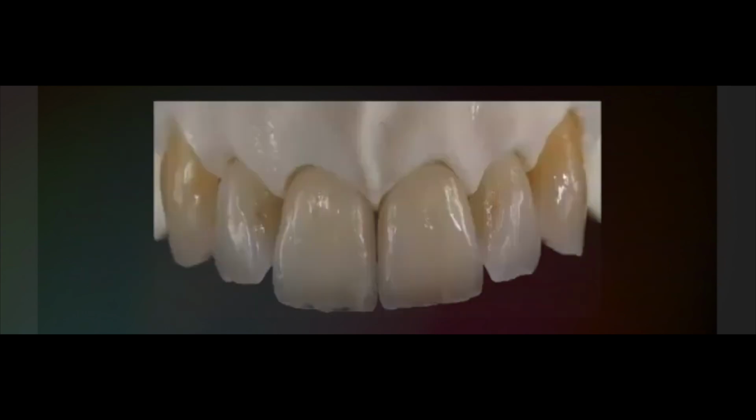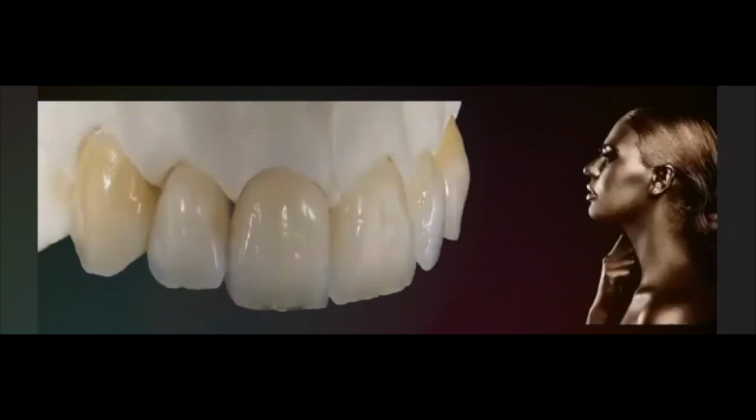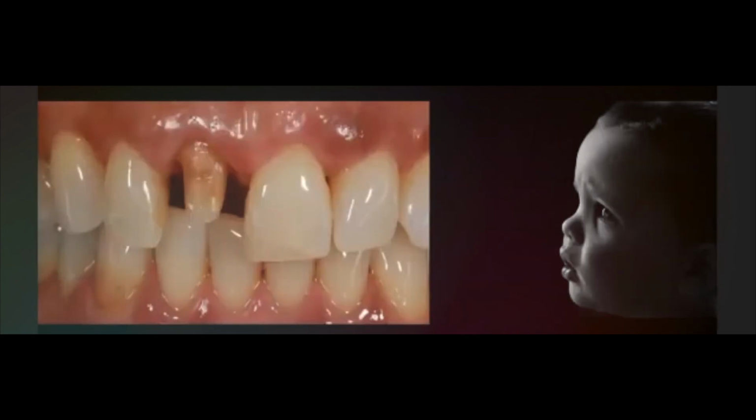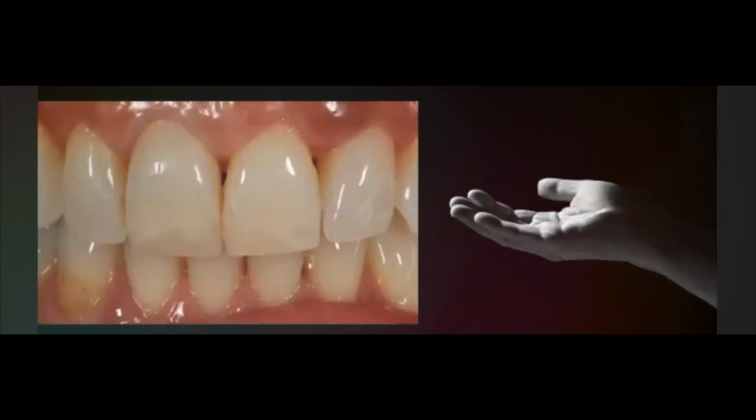And when we need to apply more details, we know a lot of techniques. You can use the internal stain technique, more controllable and safe, like this, in this single central. To apply this horizontal and vertical crack, it's not possible. You need to control this. So you need to modify your technique.